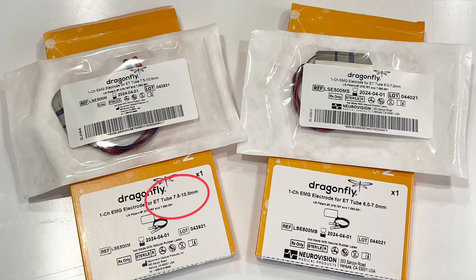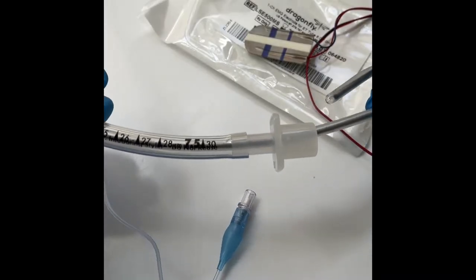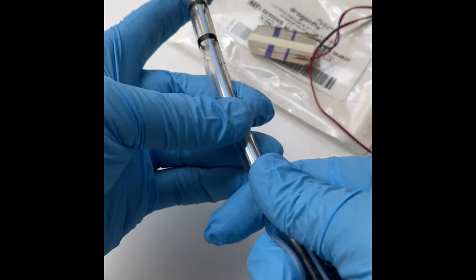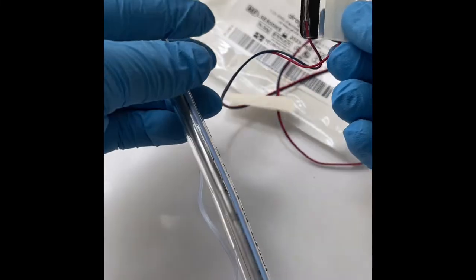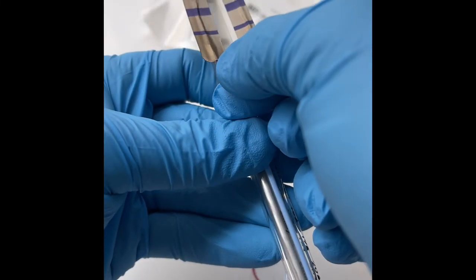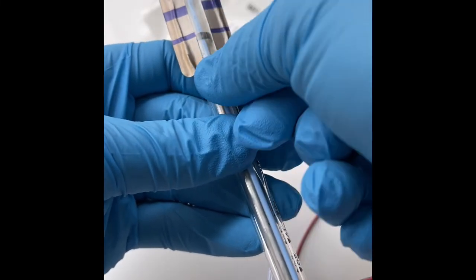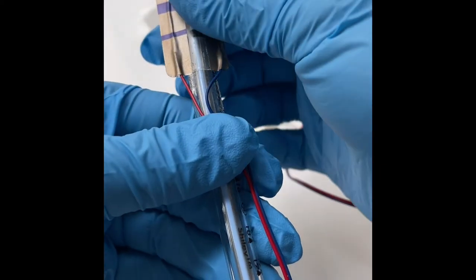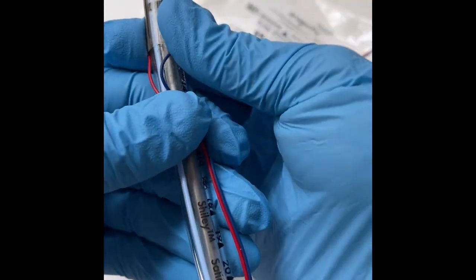Set up with your nerve monitor is simple and easy. Step 1: straighten the ET tube optimally with a stylet. Peel the release liner from the electrode and apply the electrode to the posterior side of the ET tube about a quarter of an inch above the cuff. Adhere the center first and smooth out the sides. The electrode contains depth markings for intubation alignment.